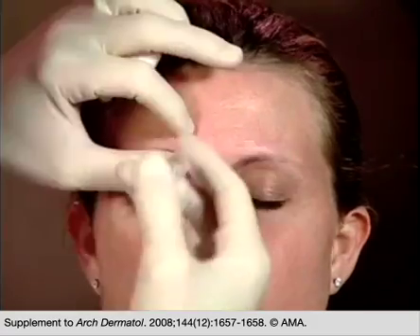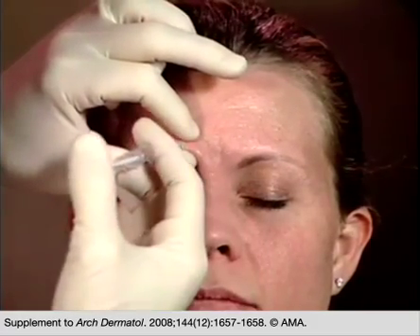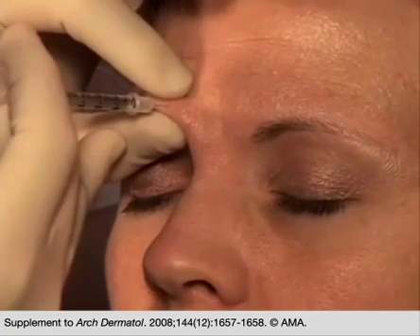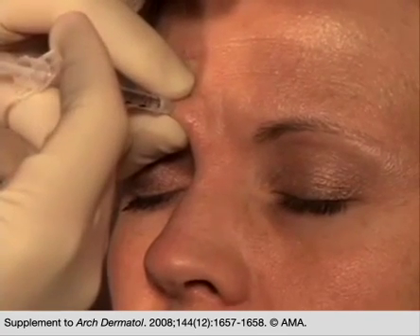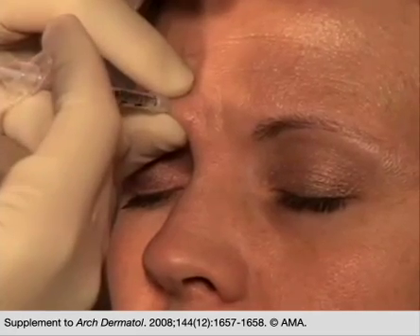Our next position typically is the right corrugator. When this is tented up, I can very clearly see a nice follicular opening. I try to stay as perpendicular as possible to the skin, and again inject another four units of botulinum toxin.